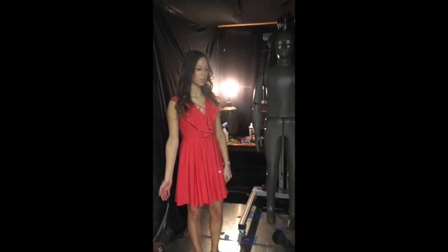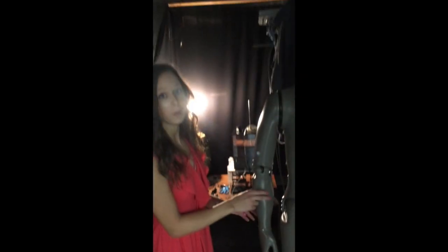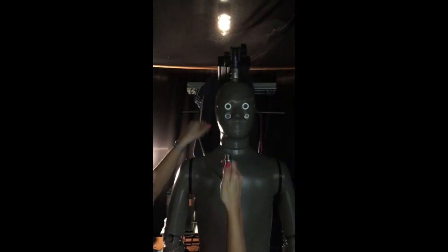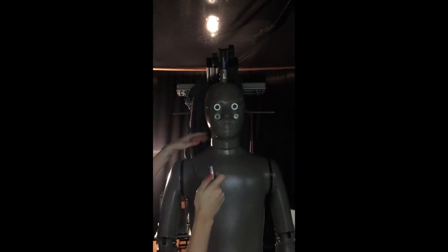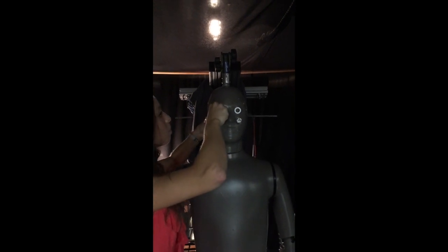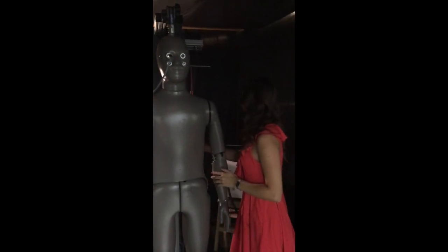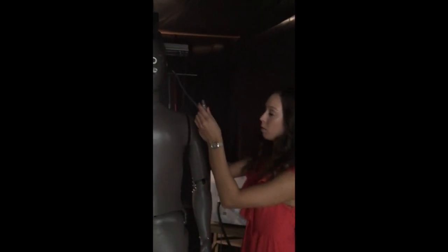Before you start your test, place the mannequin right above the X and make sure the backbone is above the drain hole. Next, you'll plug in the sockets. This socket with the 9 pinholes goes into the right eye. The dash should be lined up with the red, and place it in until it clicks. Next, you'll line up the 4 pinhole into the left eye.